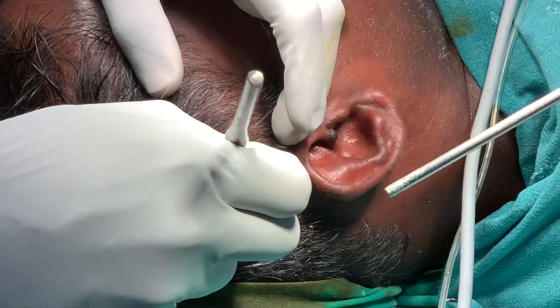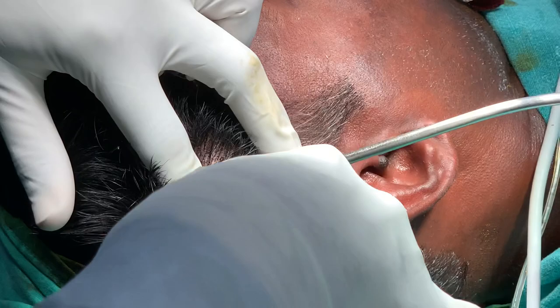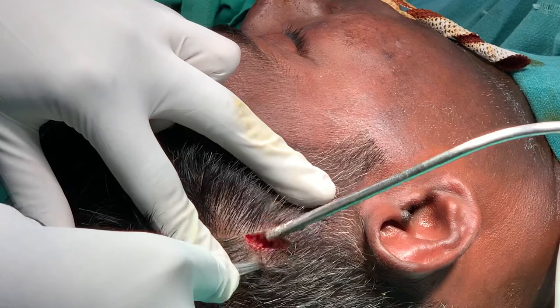We're doing a Gillies temporal approach for a zygomatic arch fracture. You could have the hair shaved if you want. I've made the incision — the first step is to look for the glistening membrane.